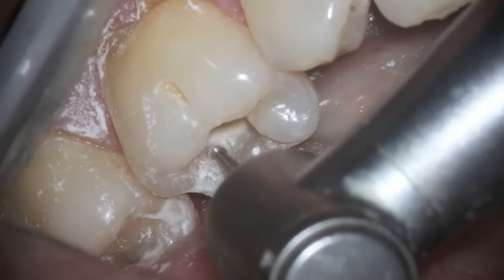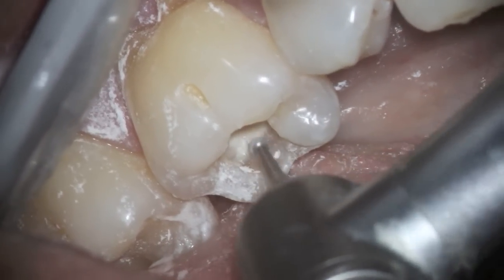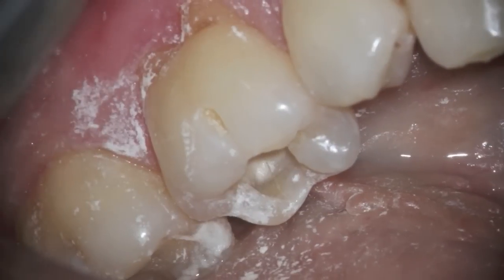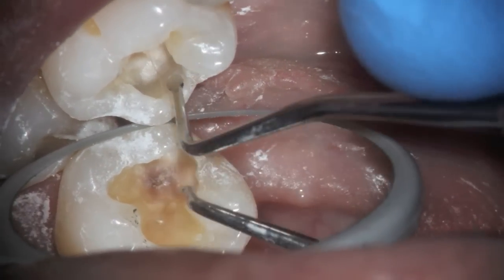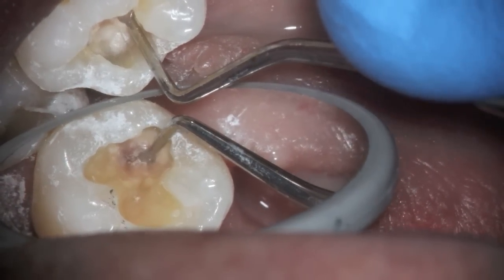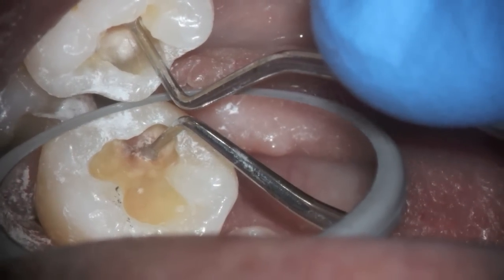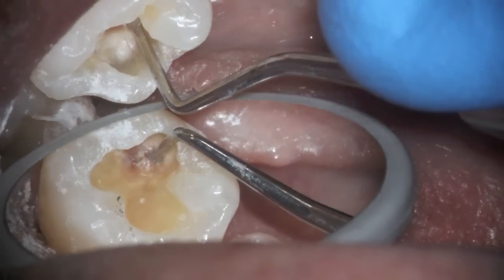And there it is — you can't really leave that there. The person is going to end up fracturing the tooth and losing it. So this is a crown buildup with a preparation, with the idea that we'll eventually go ahead and place the crown. You can see how the tooth is being peeled away now, and all of that needs to be removed.